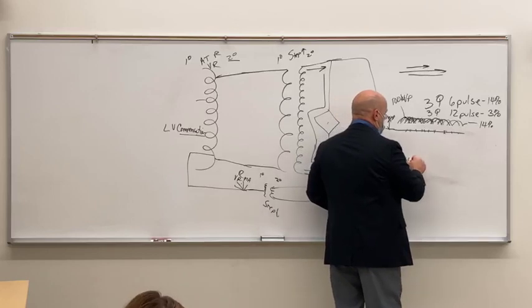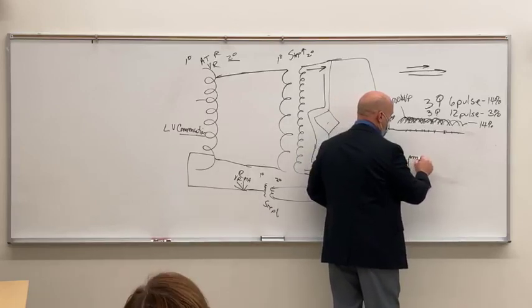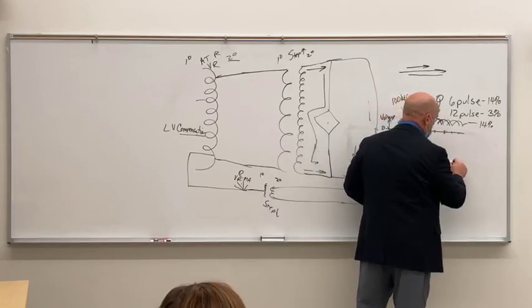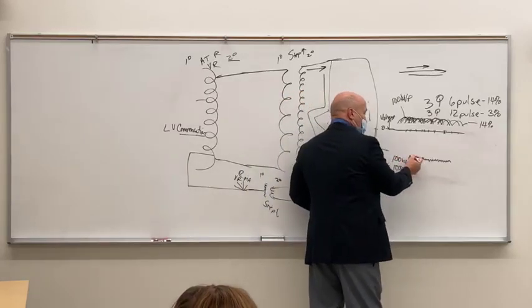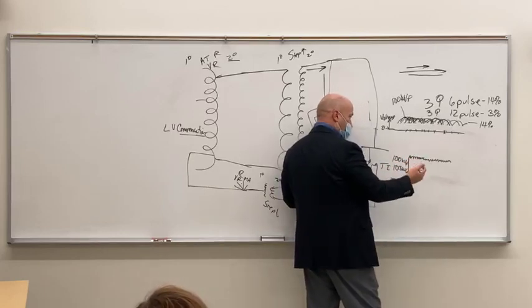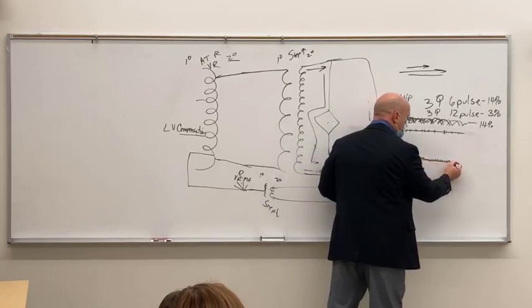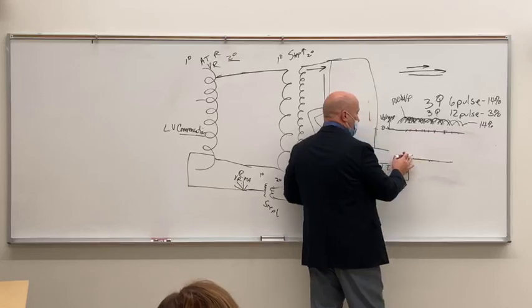So you make your exposure and it boosts it to a point where now you're on 3-phase 12 pulse, so you've got this 3% voltage ripple, and that 3% is fluctuation at top and bottom, and what it does is it comes back in, the voltage waveform is cut off at 100%, so that your voltage ripple just all but disappears.